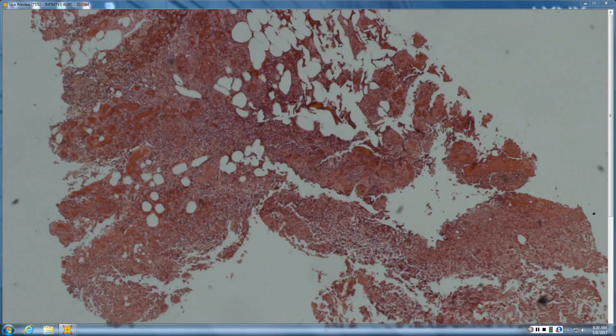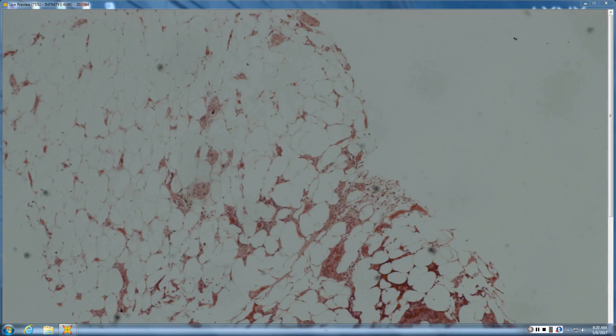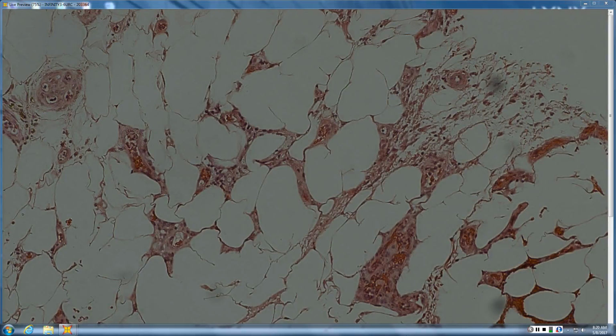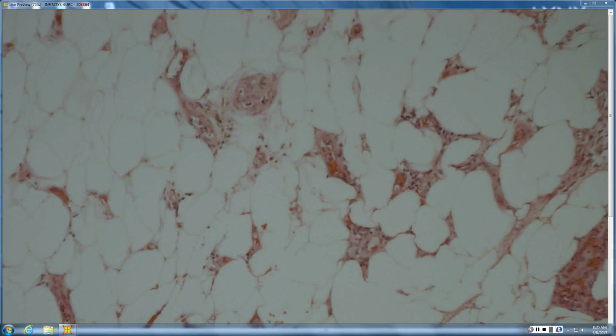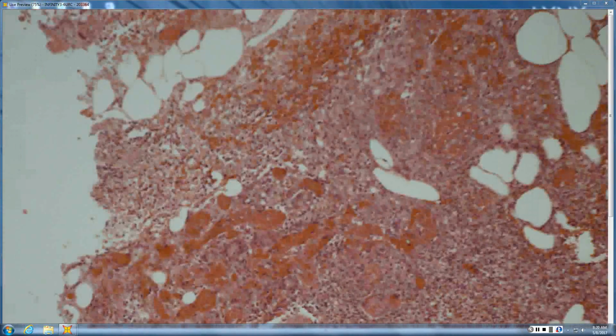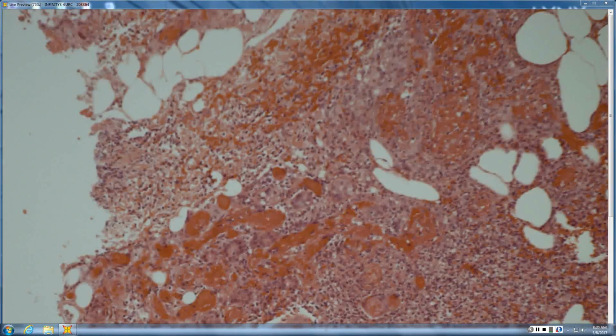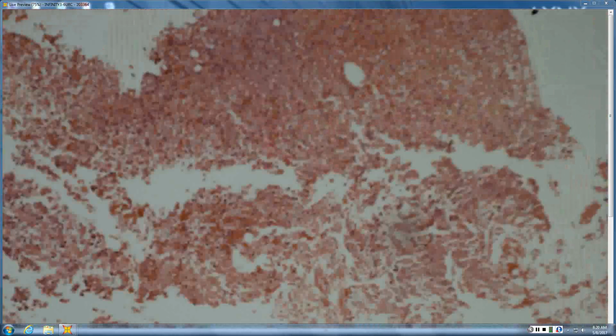Looks like an infiltrate down into the fat. Yeah. This is another one with lots of writing, so we're going to have to work our way through it. Looks more septal. I mean, the lobules are preserved. And there's certainly a lot of necrosis here, right? So neutrophils, necrosis in the fat.